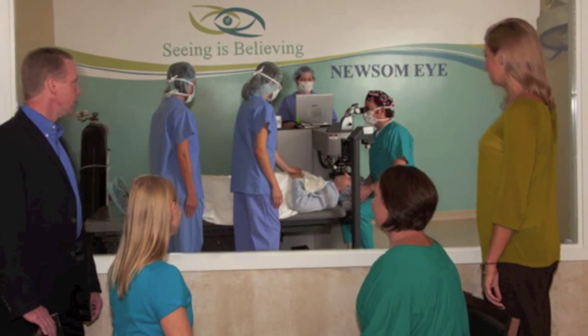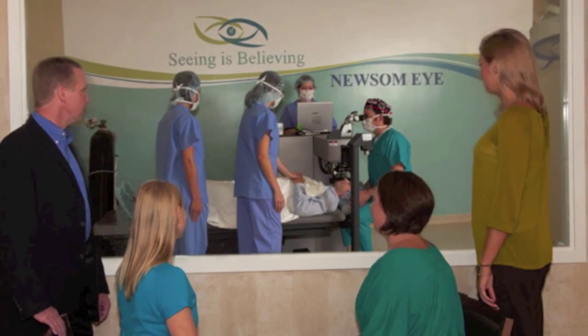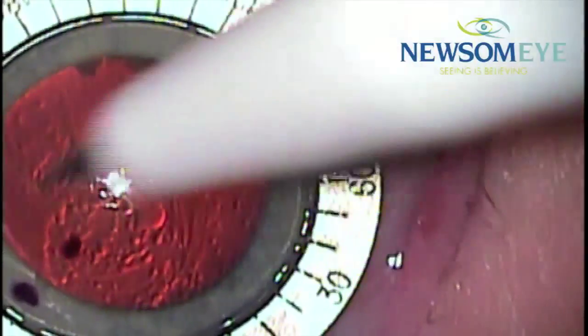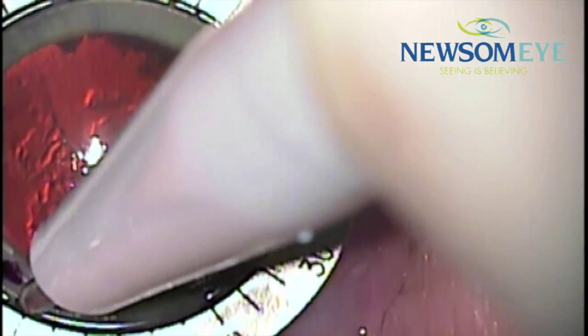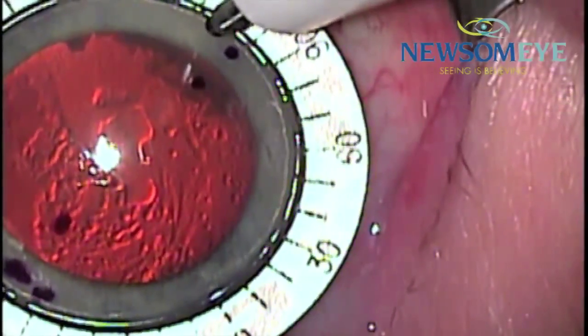This is our observation window where your family is able to observe your surgery live. This patient's cataract is being marked along the axis of the astigmatism.